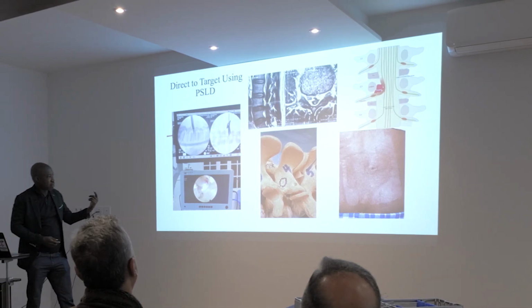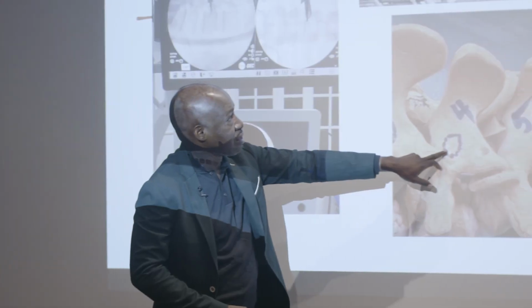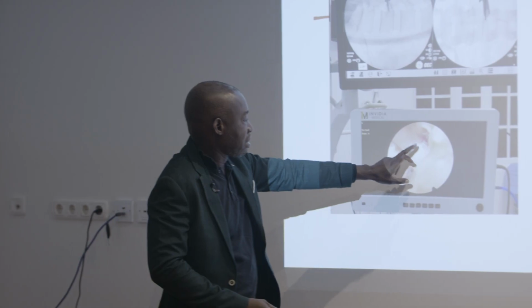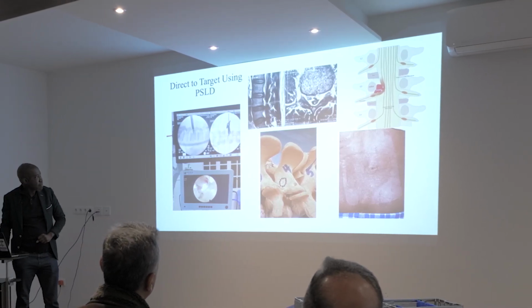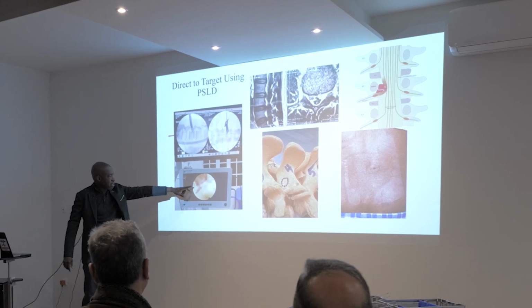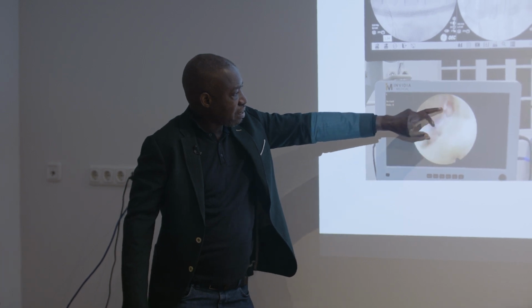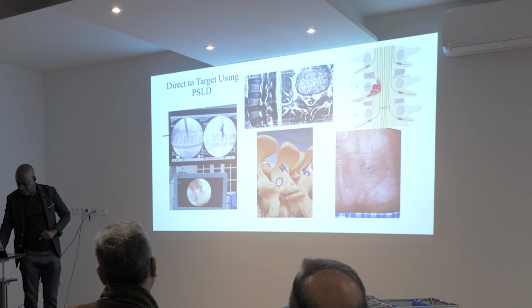Translaminar, yeah. So I just went directly to the target, translaminally, and then I picked it out, and the patient is pain-free. We can see here, this is the lateral aspect, and then the neural structures are here, and that's where we decompressed.